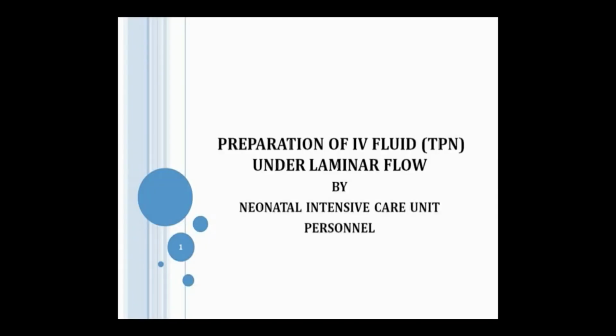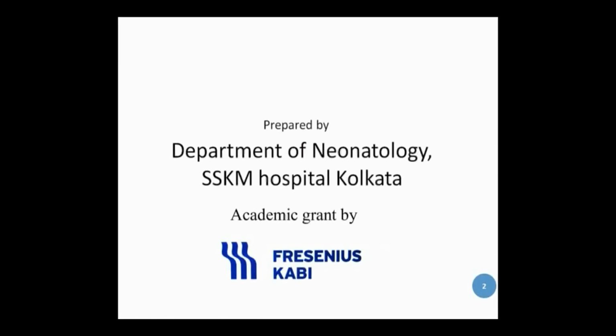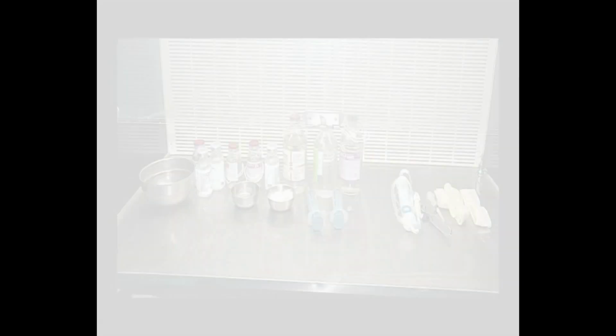Preparation of IV fluid under laminar flow by neonatal intensive care unit personnel. This is prepared by the Department of Neonatology, SSKM, Kolkata.